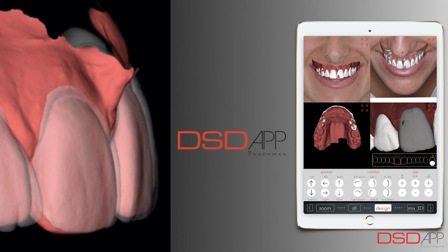The second reason why the mock-up is very important is for our treatment planning purposes. With the mock-up in place, we're able to evaluate patients' aesthetics and function, and it will serve as a reference for our future treatment. Remember that we as dentists are architects of our patients' smiles, so we have to plan, create blueprints and mock-ups that will help us dictate how the treatment will be continued in the following steps.